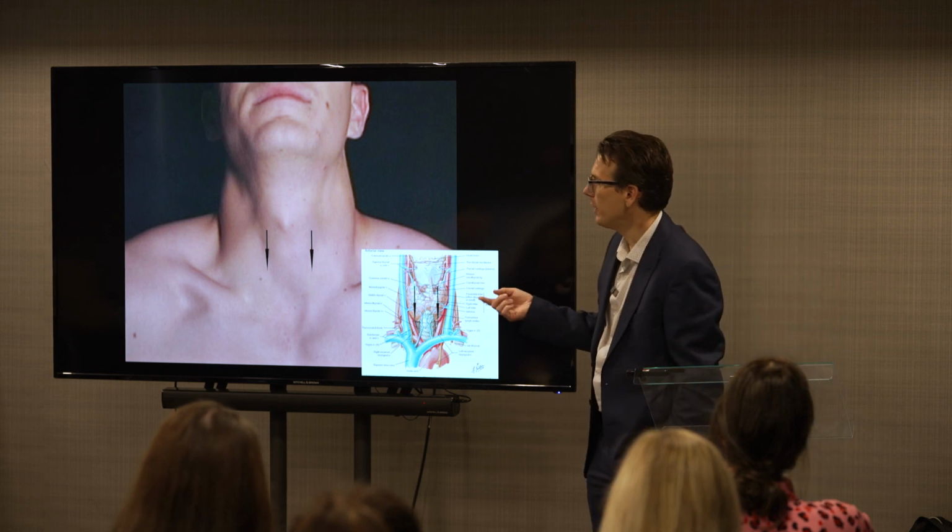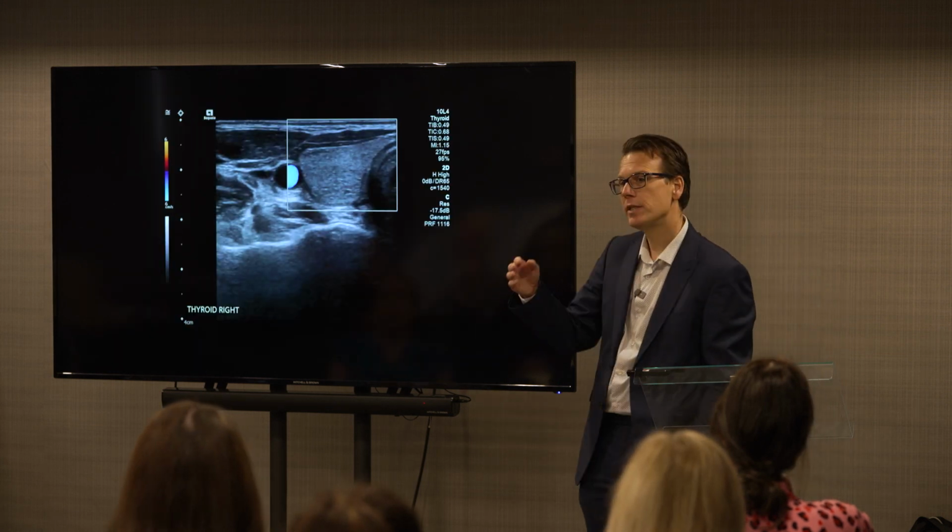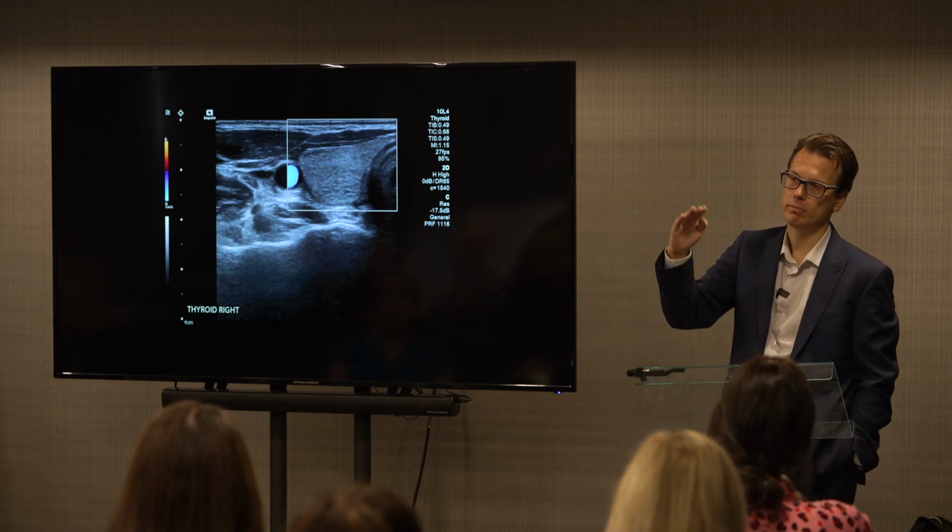So can you go to the next slide? I tend to start at the top and scroll down.